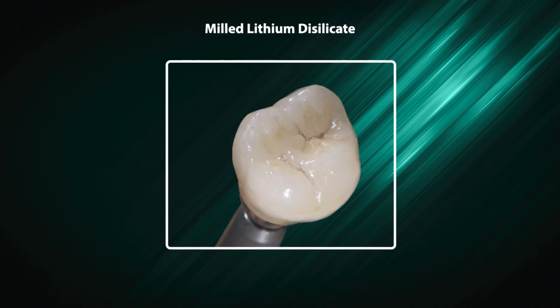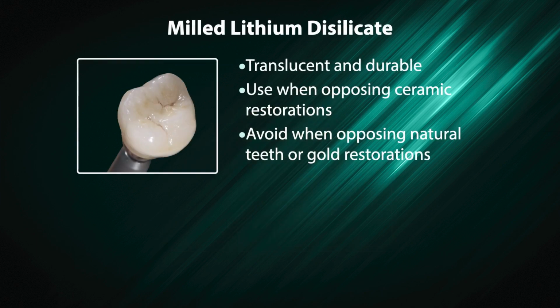Milled lithium disilicate. It is both translucent and durable, for use when opposing ceramic restorations. Please note that it should be avoided when opposing natural teeth or gold restorations.